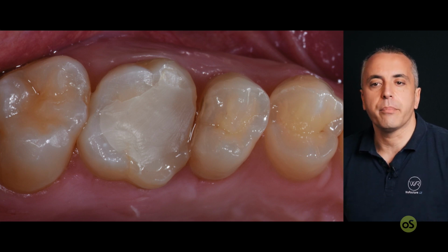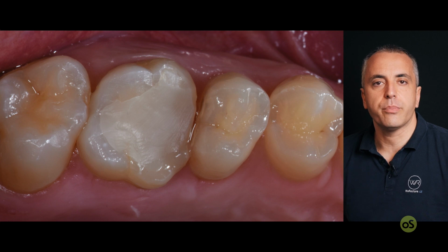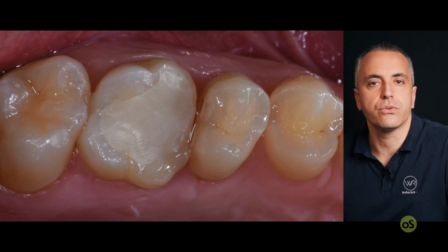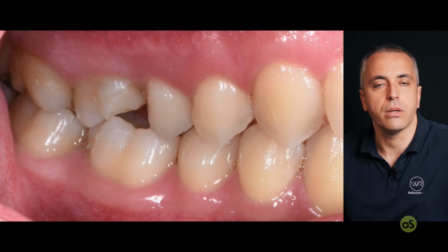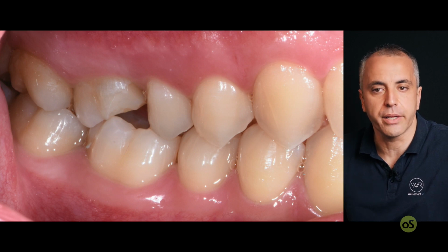This is the clinical appearance of the clinical case. We'll see clearly that on the second premolar, on the distal part, we can see the translucency of the demineralized tissue, so there is a class 2 over there. Then there is already a build-up with the margin relocation on the first upper molar, and there will be a slot restoration on the second molar, on the mesial aspect, facing the overlay.